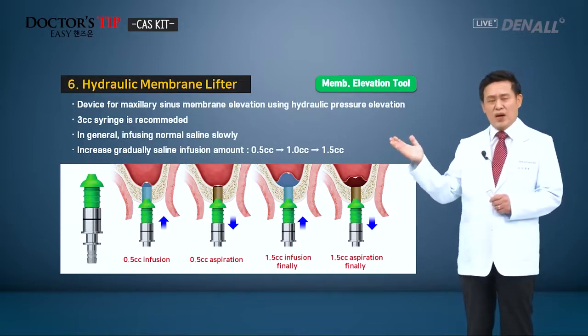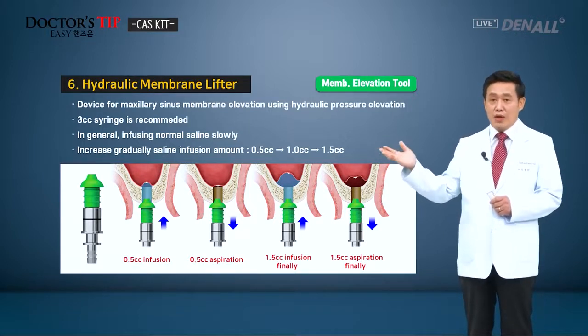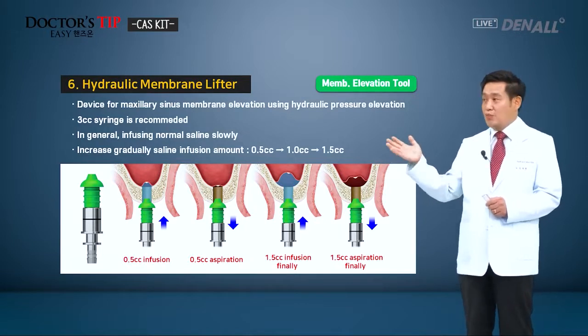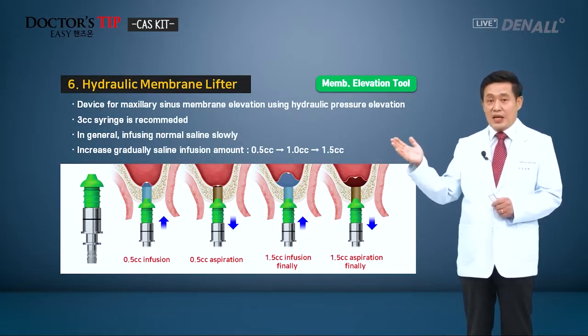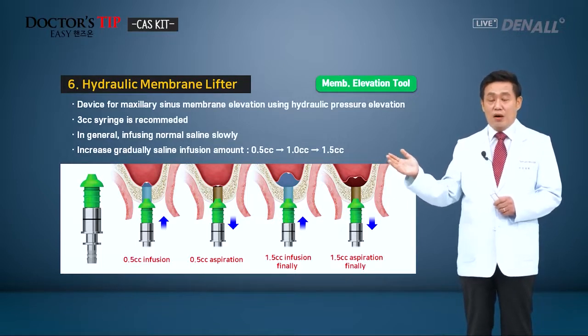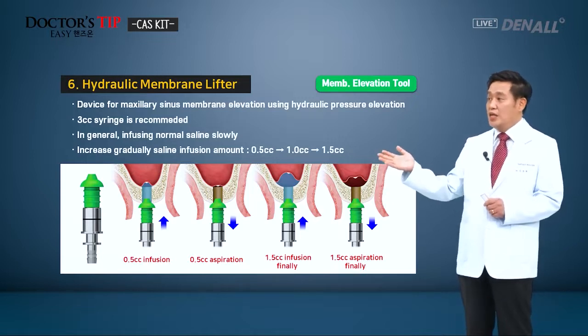When you use it, we cannot accurately detect the tearing of the membrane. Using the Valsalva maneuver, you can check and stop the procedure. But if there is minor damage, you will not be able to feel the tearing.